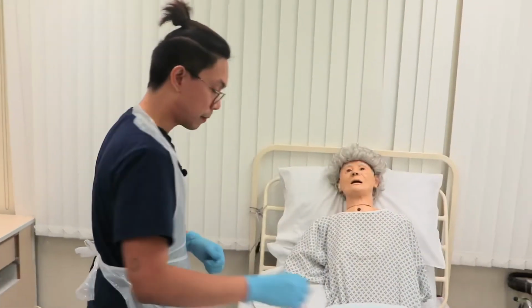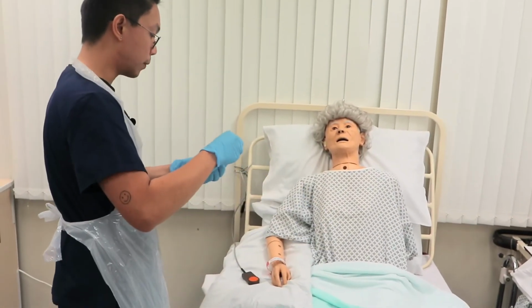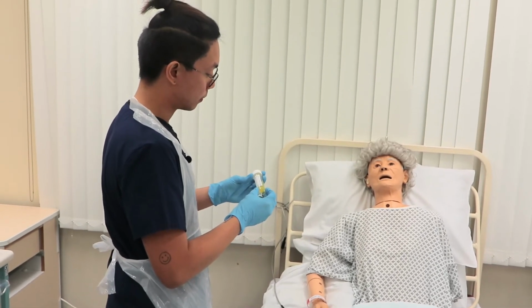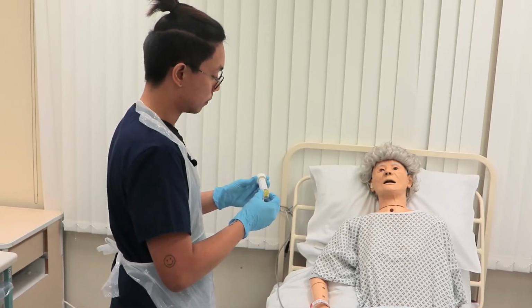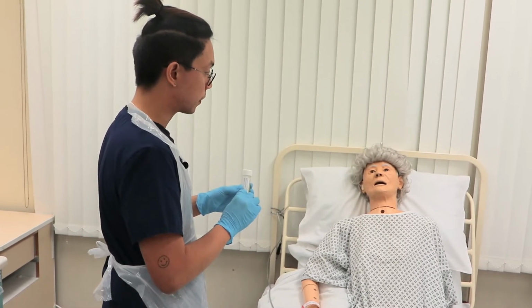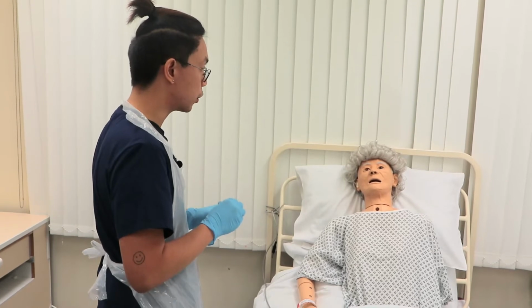So Catherine, I am back. So I've got here your sample. Do you mind just confirming me your name and date of birth? Yes, it's Catherine Miles, 3rd of 11th, 1980. And can I just confirm that you've collected this midstream? Yes, it is. Okay, so just give me a minute. I'll just do your urinalysis, okay?